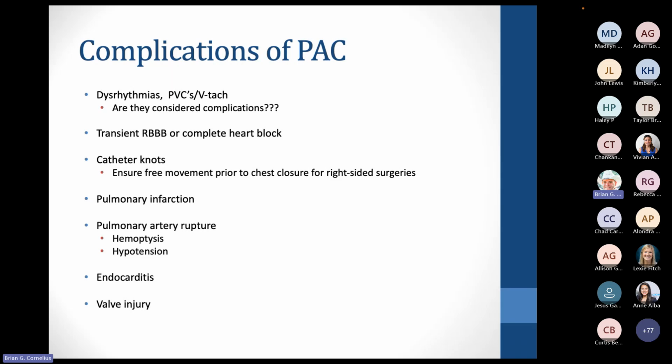So before we close those chests, we'll go ahead and make sure that we have free movement of the catheter. Just be cautious with that. If your catheter were to become inadvertently inflated and not detected, you do run the risk of having a pulmonary infarct. Because if you think about it, that balloon being inflated means there's no blood getting past it. So any tissue distal to that is no longer perfusing.